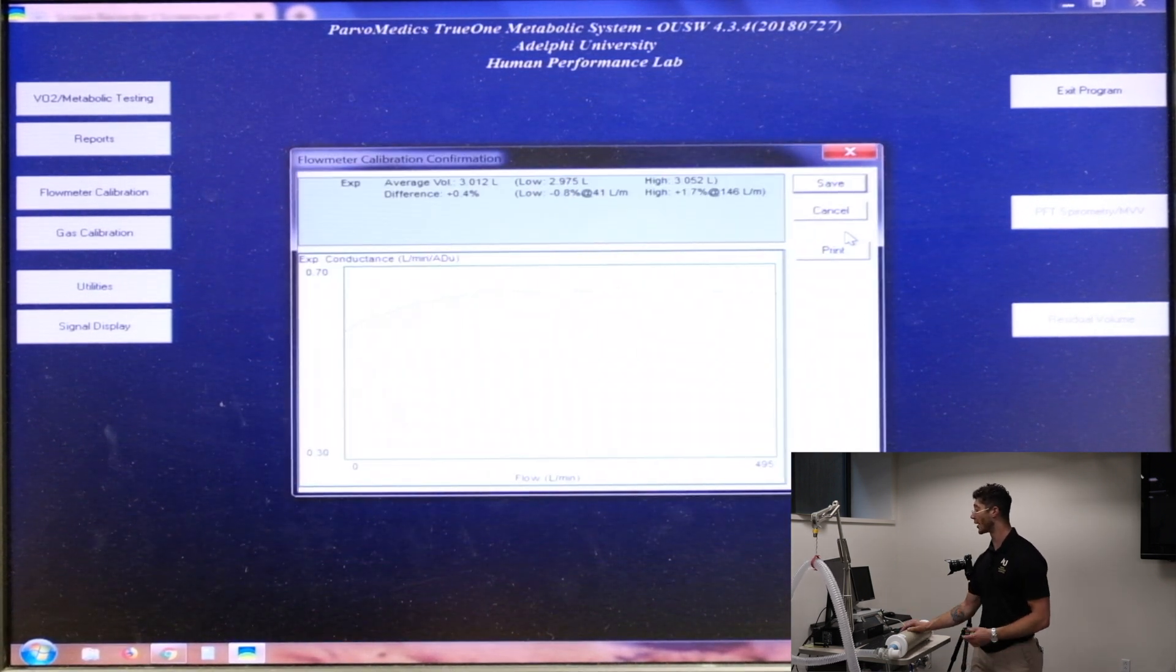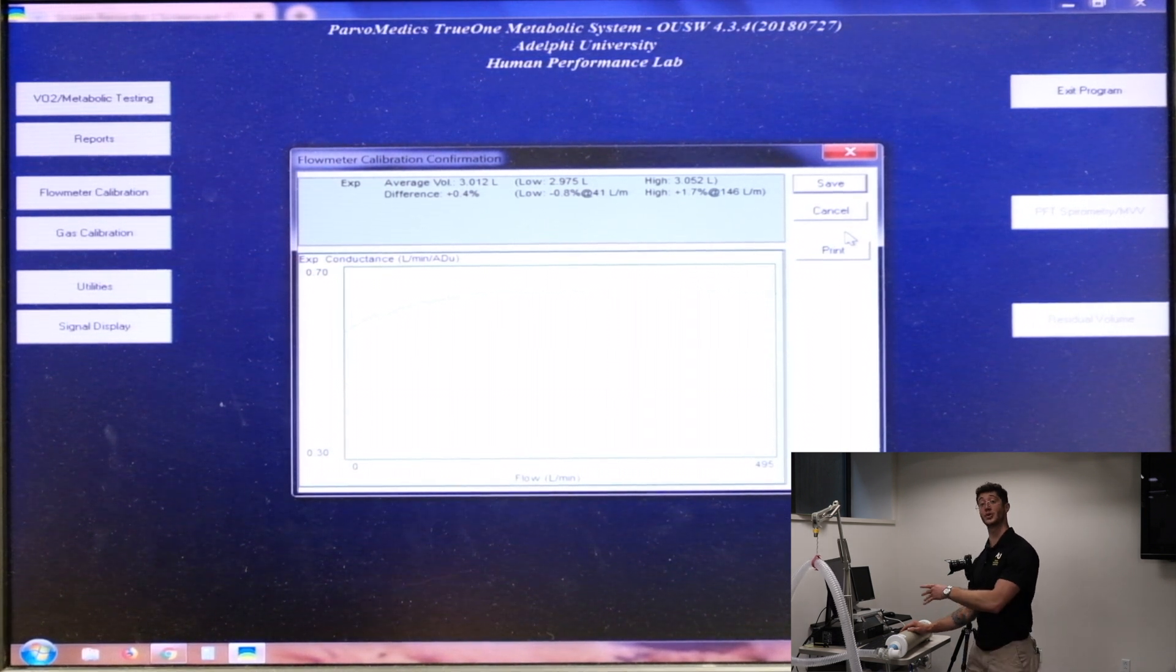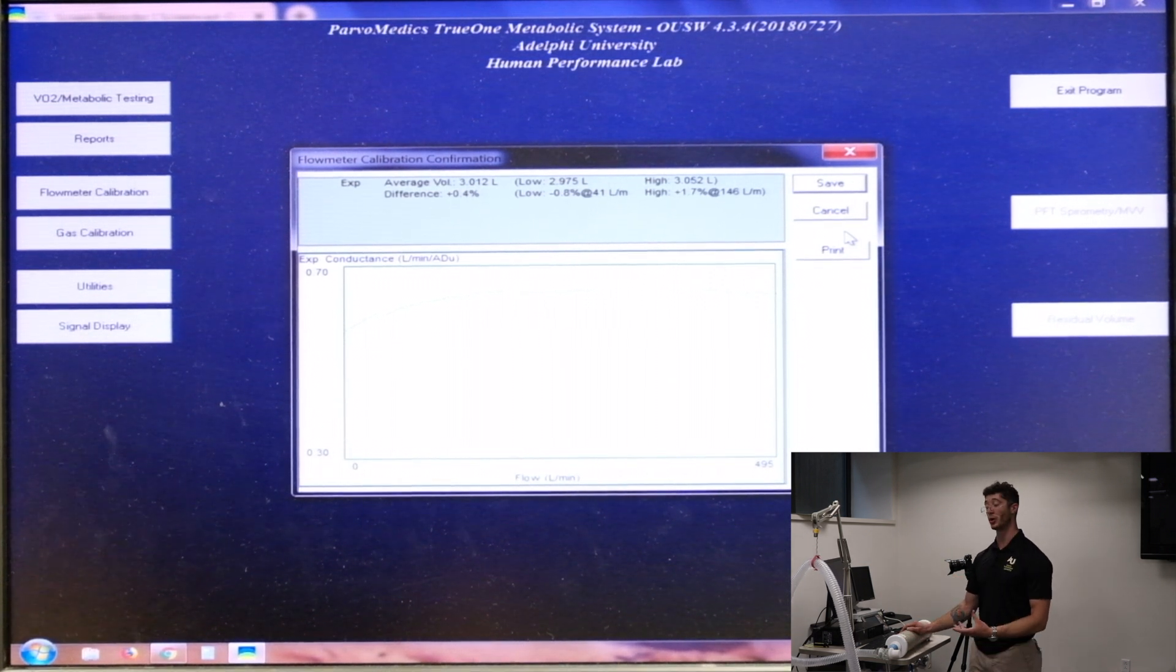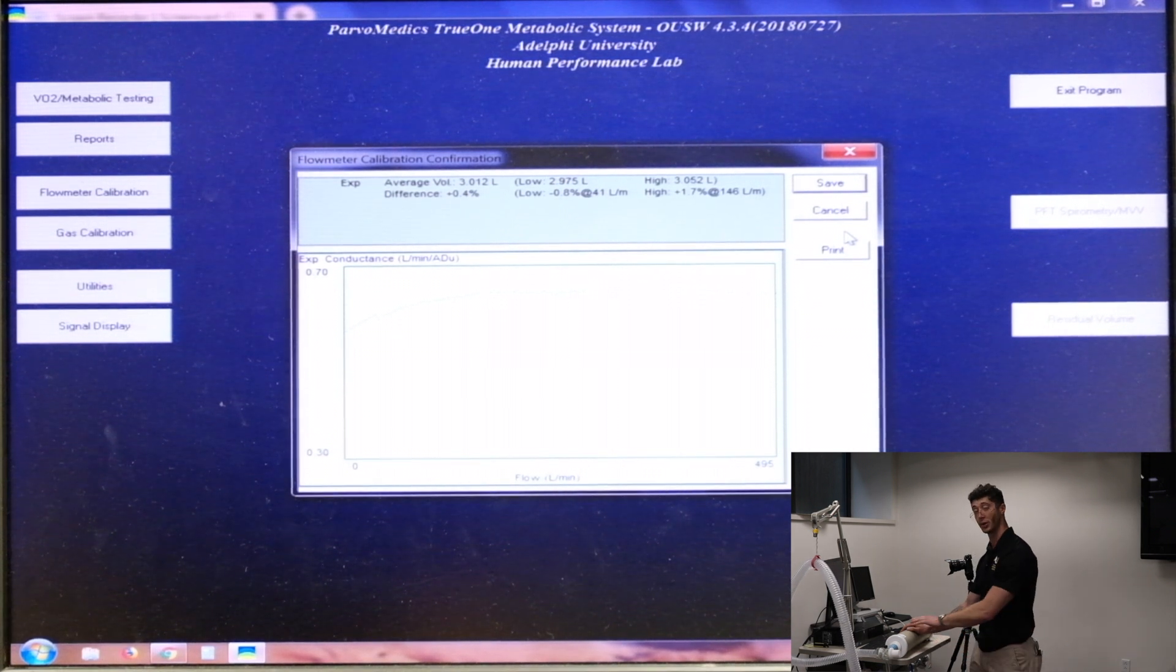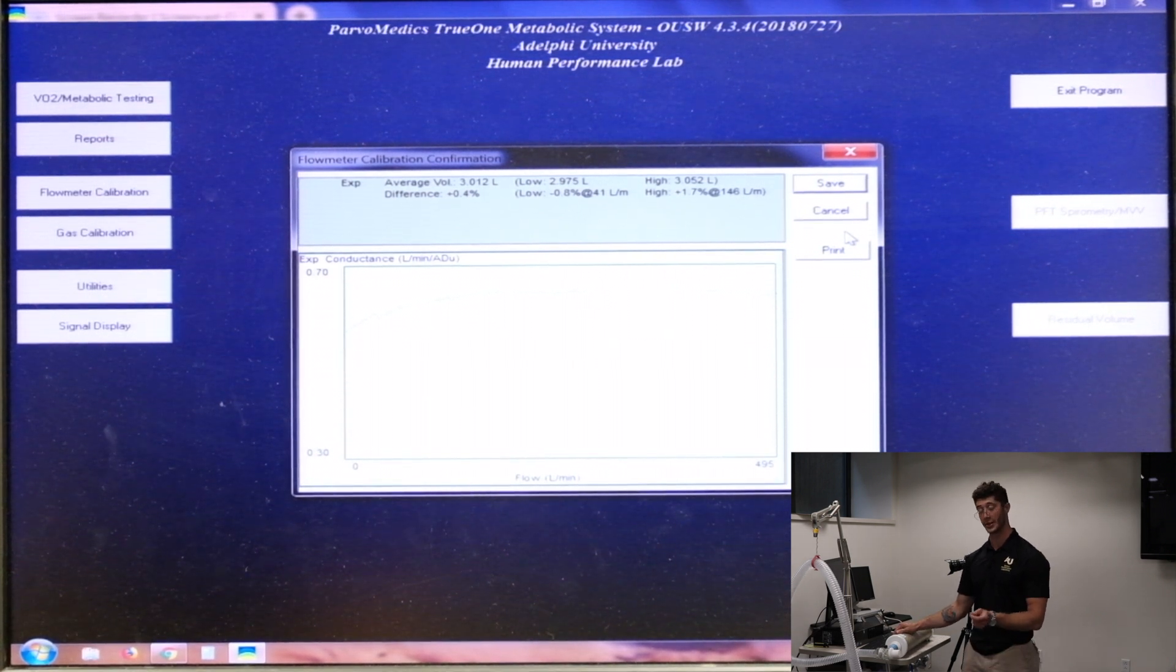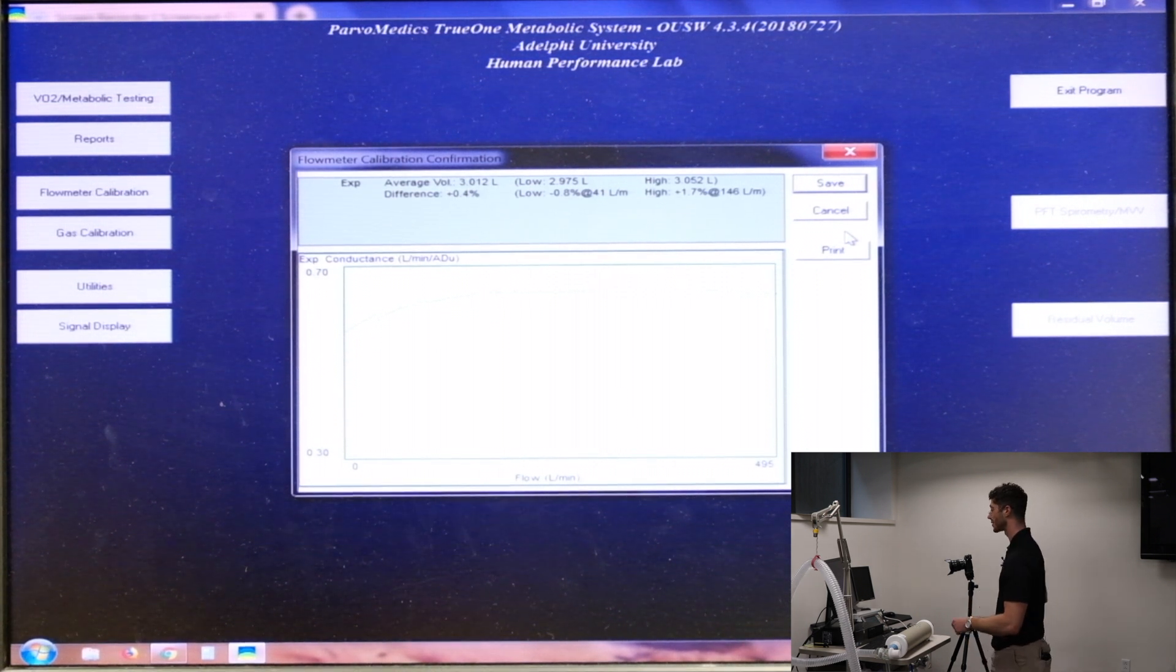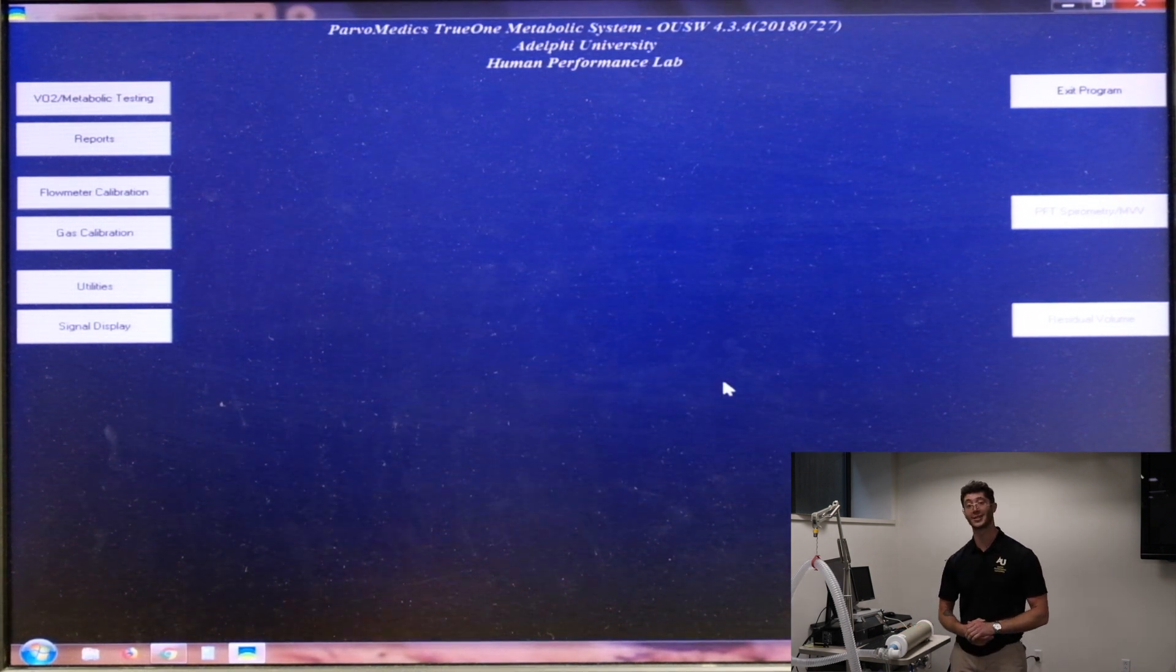So as you can see, we got an average volume of 3.012 liters, which is pretty close to the three liters that we know is going through the system. The difference is positive 0.4%. So 3.012 is 0.4% greater than the three liters. So that is within our range. Our range is less than 0.5% off of 0. And we can actually get started with our test now that that's complete. So we'll hit save. And that concludes the calibration process.